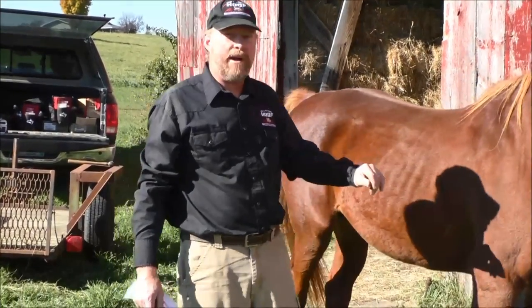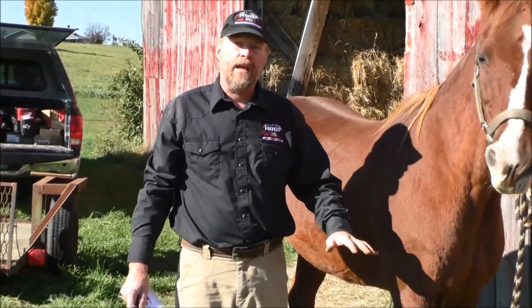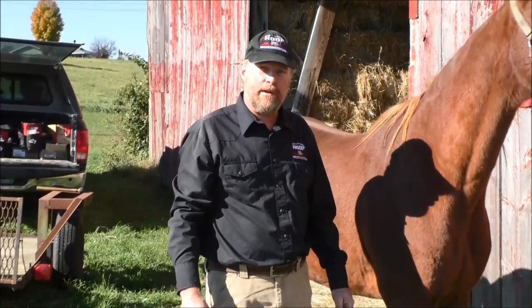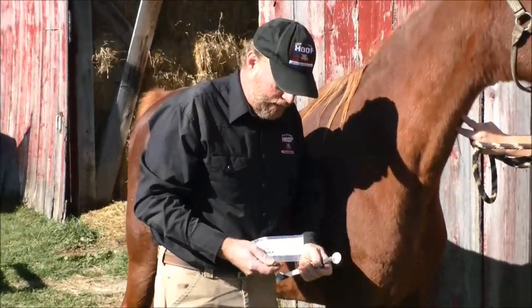If you have a horse that's a prior founder or is in an acute stage but comfortable enough to pick his feet up, you can use your hoof stand to do the work just like you would normally bring the foot forward in any farrier work. Once again, straighten the hoof wall out from the coronary band to the toe the best you can, and then do the application like we did on the other side.